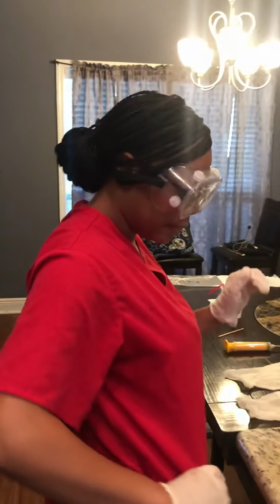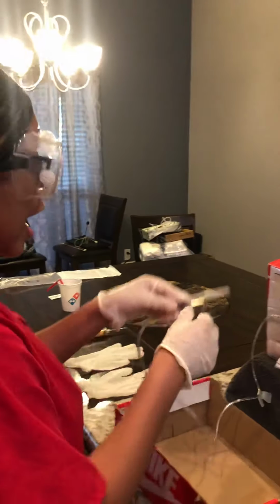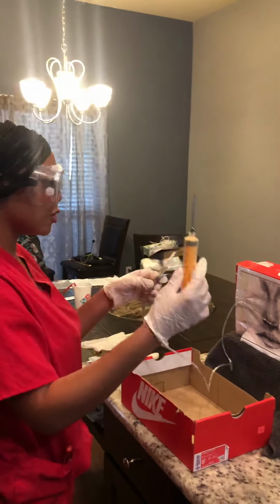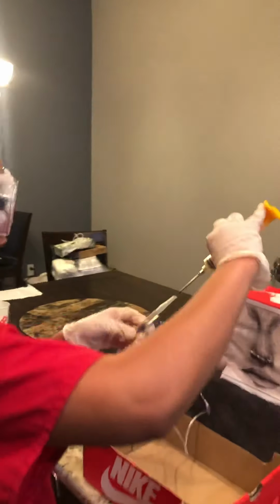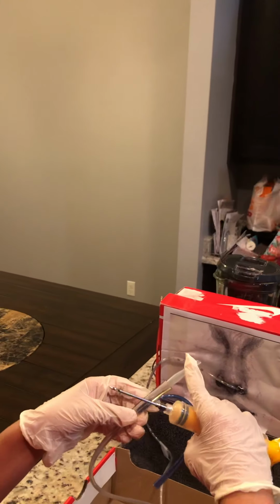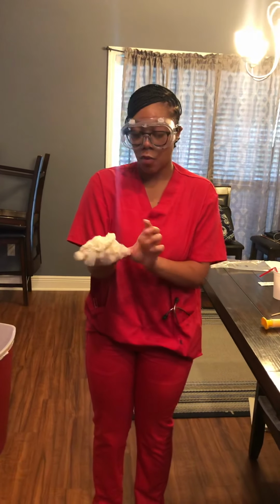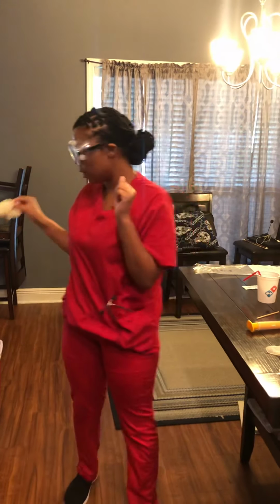After I have done that, I'll make sure to connect my 60 milliliter syringe, which I do not have, and I will attach it to this ending of my NG tube. Next thing that I will do is, in the following steps, I would dispose of my clean gloves, perform hand hygiene.